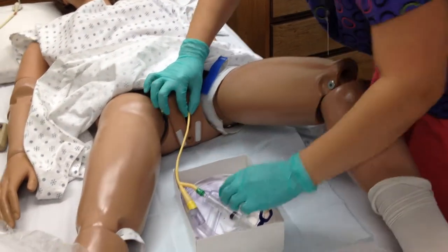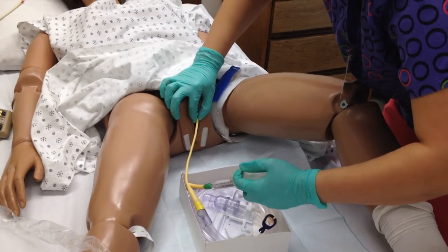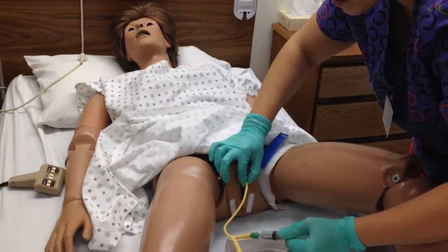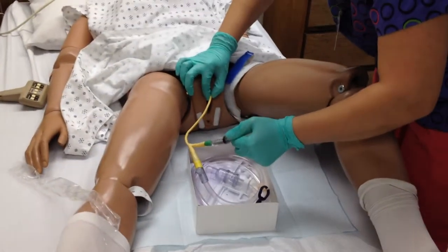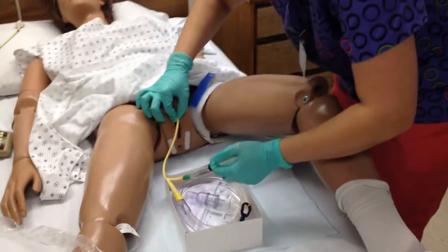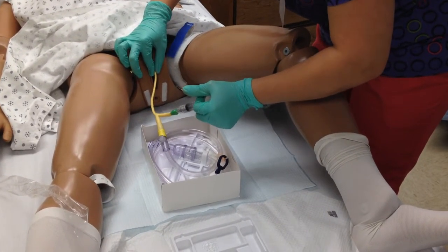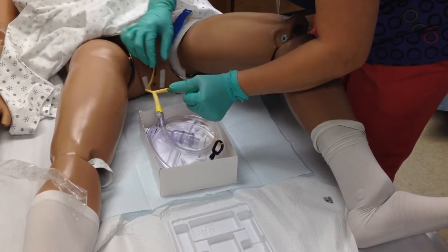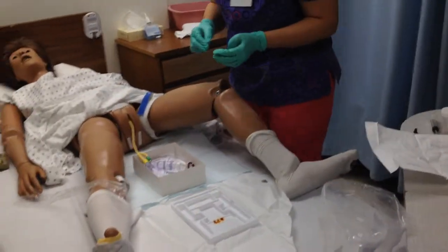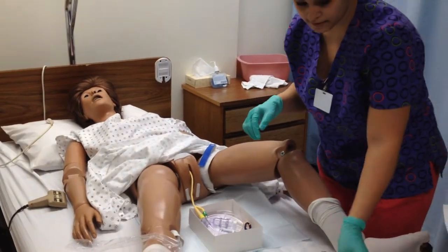Now I'm going to hold it here with my contaminated hand. I'm going to insert 10 mils of water. And I would check for facial grimacing and ask them if they were having any pain or discomfort. Hold it here, take it off. Okay, then I would pull back on this a little bit, of course, to make sure that it's in. Now I can clean my stuff up.